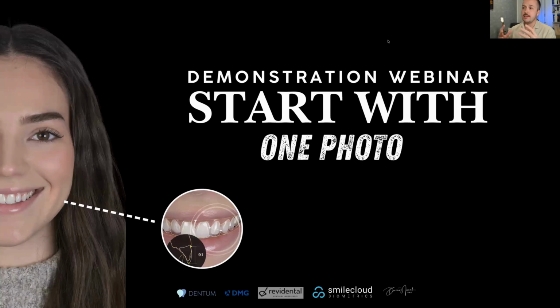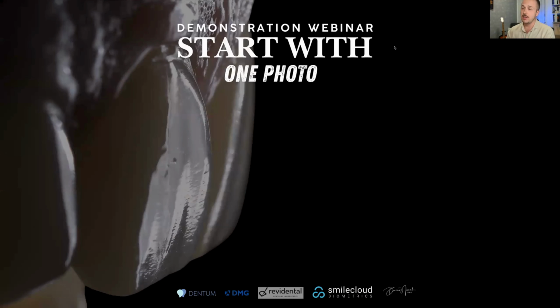The topic of today's demonstration webinar is "Start with One Photo", where we want to cover a new approach in dentistry, where we just use one photo for the initial consultations, and how we develop communication and a certain protocol with the patients to input their wishes into designing and presenting the new smiles. It's a narrative where we actually show our patients what's possible in the end.